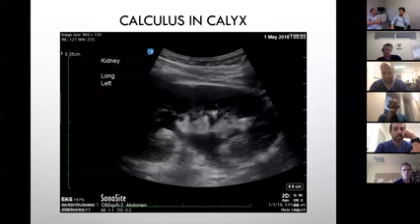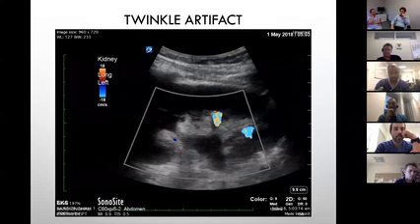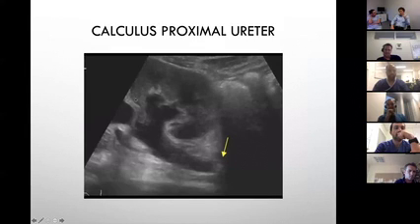But we classically want to see the echogenic focus with the shadow going down to call it a stone. That doesn't happen in intrarenal stones because they're tiny ones. The sound wave just goes around it pretty much. So that's why the color is helpful to pick those spots up. All right, so that's your kidney.